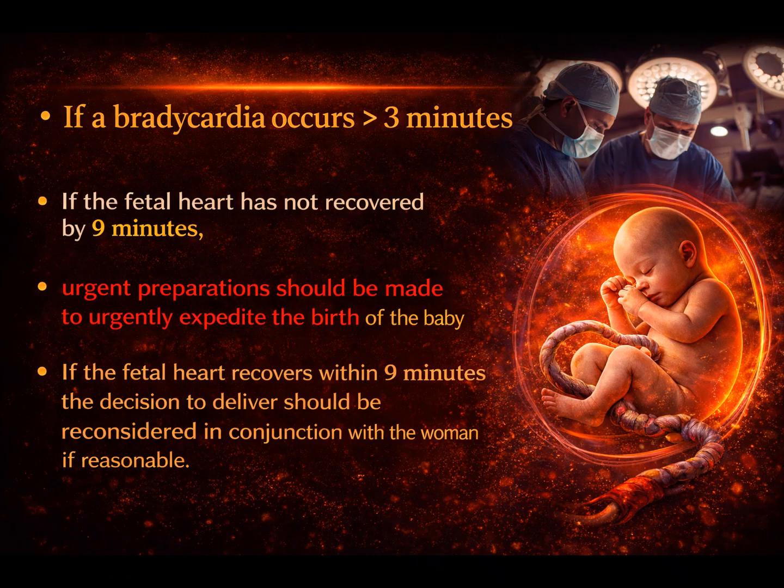So if bradycardia occurs for more than 3 minutes, and the fetal heart rate does not recover by 9 minutes, urgent preparation should be made for urgent expedition of the birth of the baby. If the fetal heart rate recovers by 9 minutes, this baby and maternal condition should be reassessed by the senior consultant, or the consultant on call, and he will decide whether to continue with the process of delivery or wait.